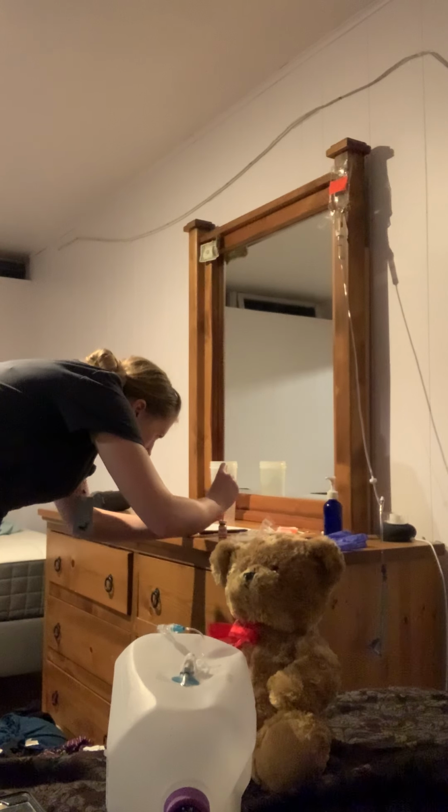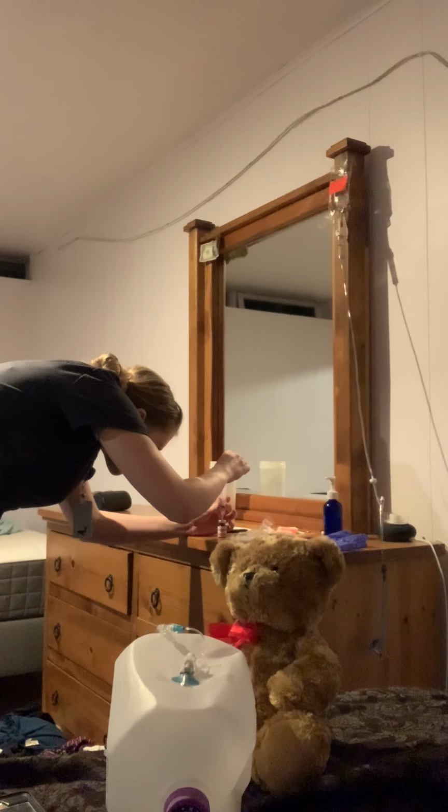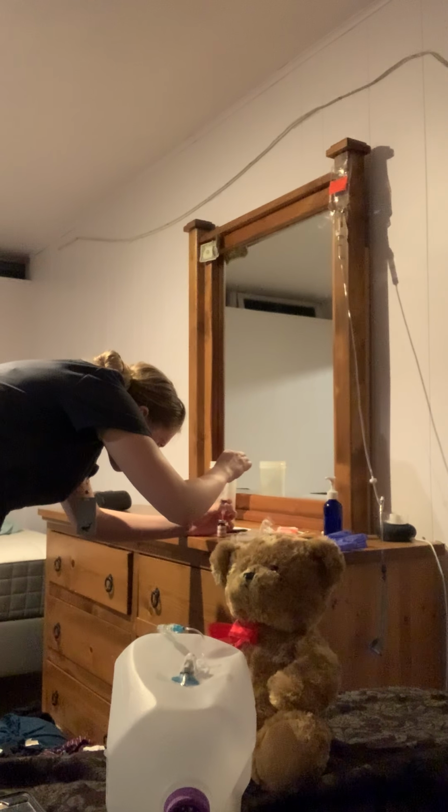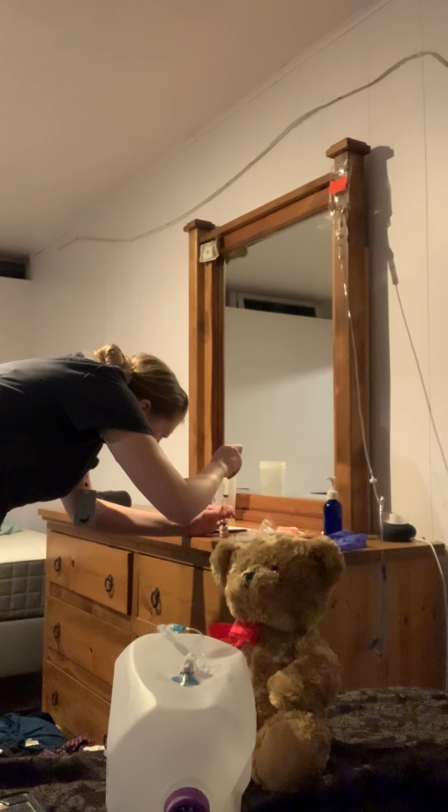Now again, drawing up 4 mils. Again, just making sure I got my 4 mils here.